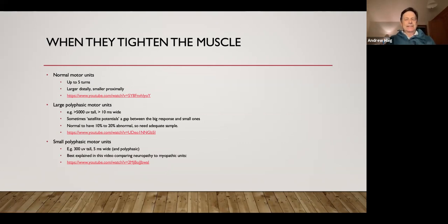Normal units, motor unit potentials, are bigger in the hands and feet than they are in, let's say, the butt, okay? Probably because there's fat between muscle cells proximally and all kinds of other reasons. We talk about norms, and I just put a random number here down below: if it's more than 5,000 microvolts, that's really too big any place. If it's in the butt muscles, boy, that's really huge. In the hand, you could almost wonder if it's not a real big deal, okay?